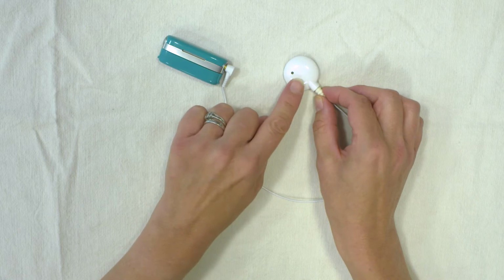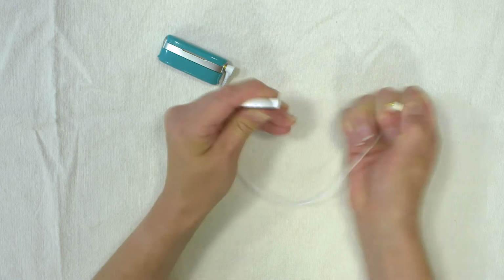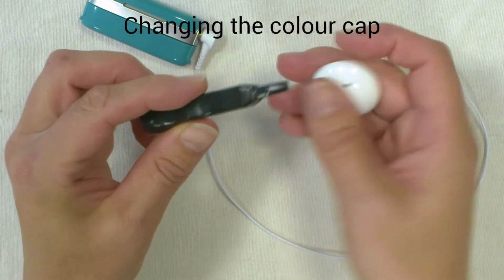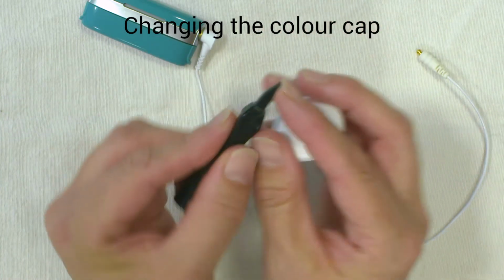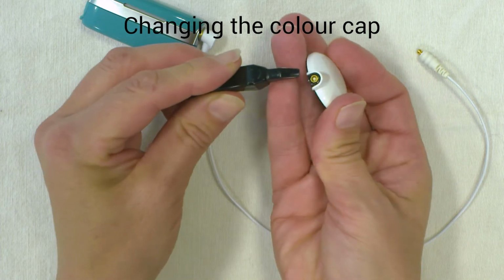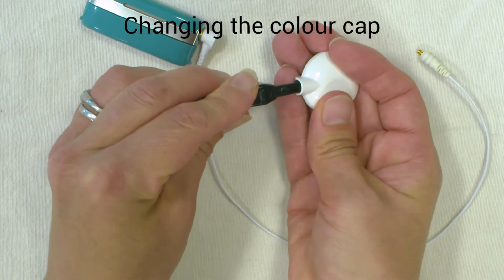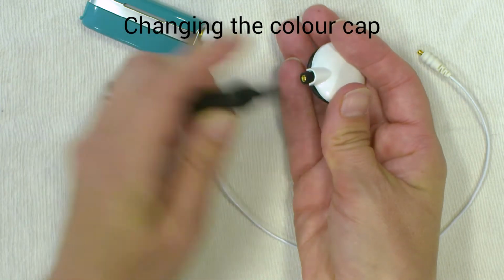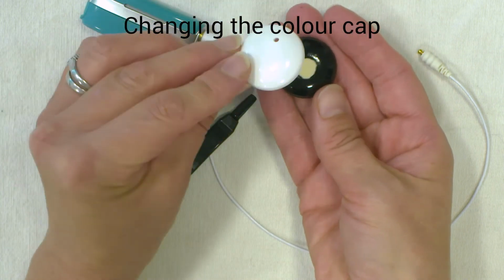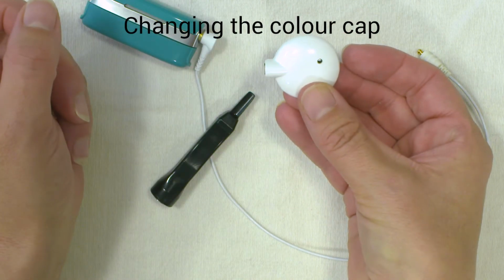There's different colour caps that come on the coil. If I take the lead out, I'll show you how to change the colour cap. You need a tool that can be found in your kit, and it's got a narrowed end that goes down to a point. If you angle this between the black and the white area, you can lever the top off. To put it back on, you just simply place it over the top and click it on.